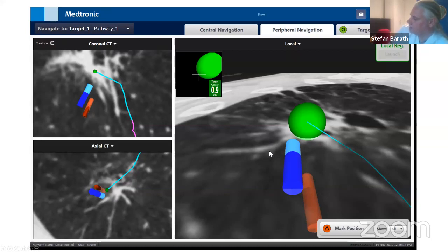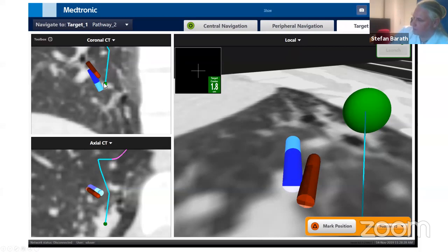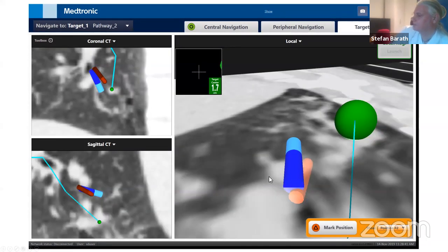And then you take your instrument, could be your biopsy forceps or whatever you use, and then see what happens with the working channel. You can see that I'm not in the same place, and I probably won't get any good sampling. But then I can try to mimic the first mark with the working channel while I have the instrument inside. And in that way, I can see it in 3 dimensions. In that way, I can make sure that I take the sample in exactly the same position as I had my EBUS verification, like that.